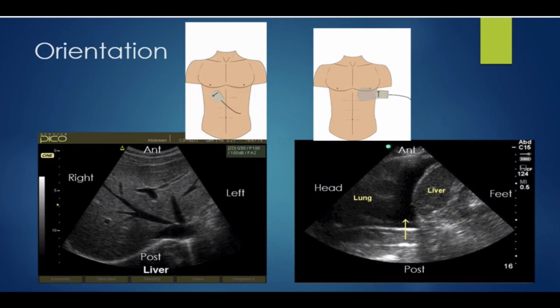On the images on the left side of the screen, we are holding the probe with the indicator pointing to the patient's right. On the image, the indicator dot corresponds to the patient's right side. The top of the screen is anterior and superficial, and the bottom of the screen is posterior and deep. Now that we are oriented, we can see that this is an image of the liver, with the hepatic veins draining into the liver and emptying into the inferior vena cava.